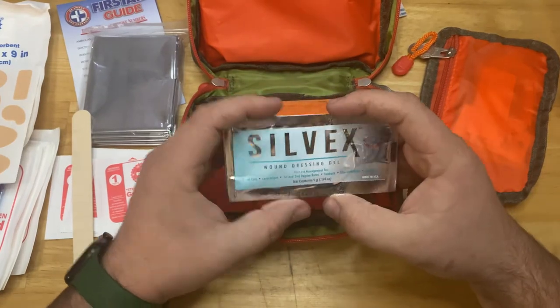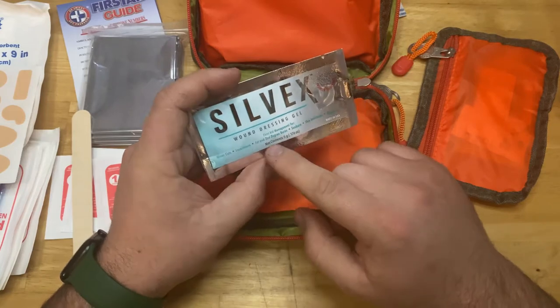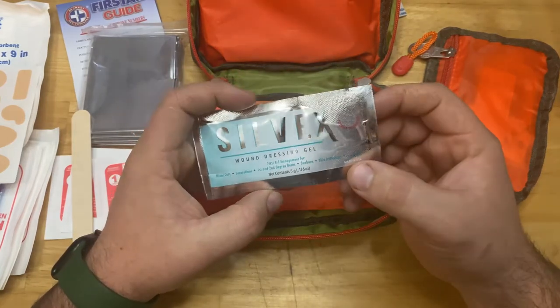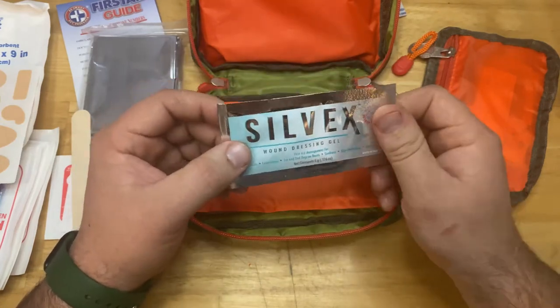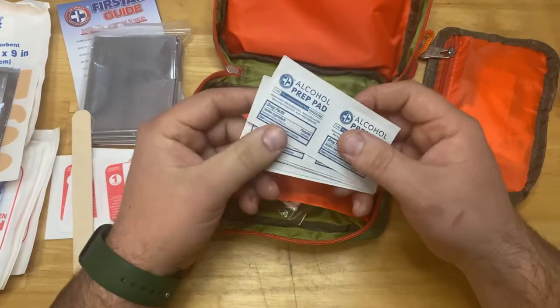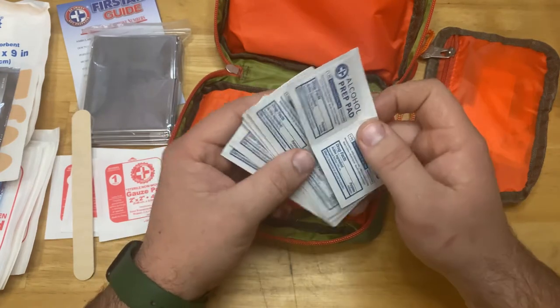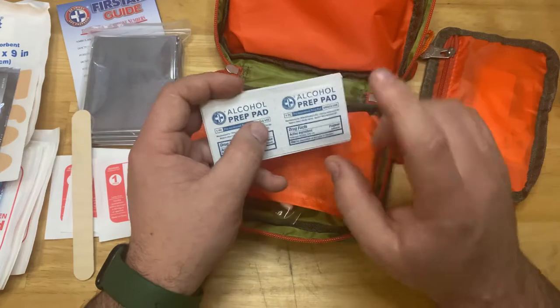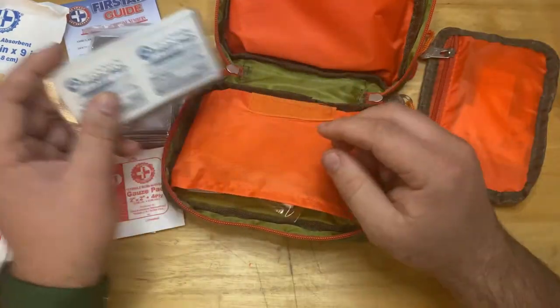This is Silvex — a wound dressing gel. It's great for minor cuts, lacerations, first and second degree burns, sunburn, skin irritants, and abrasions. Next up we have alcohol prep pads — about 10 to 12 of those. Great for cleaning up areas: if you get a minor cut or abrasion, clean it up with this, cover it with a bandage, and you're good to go.